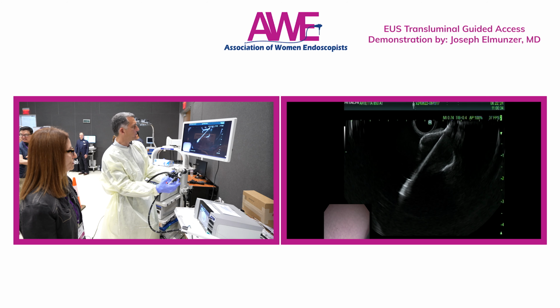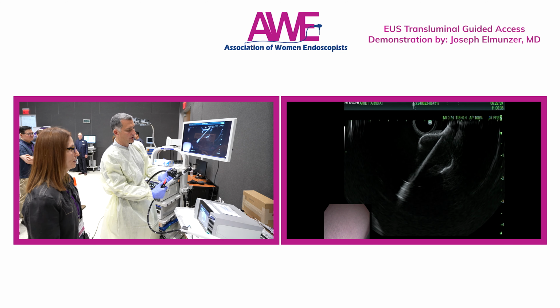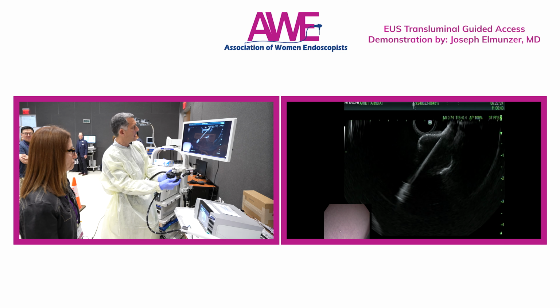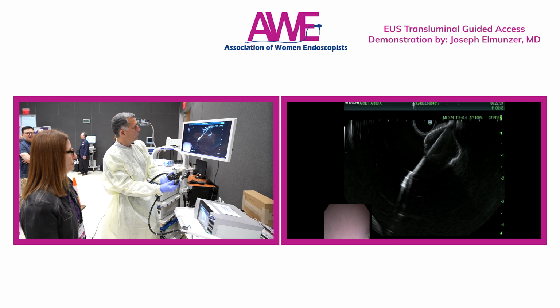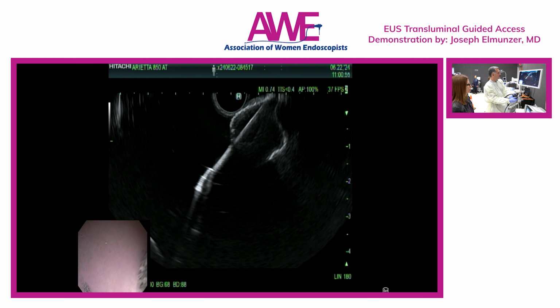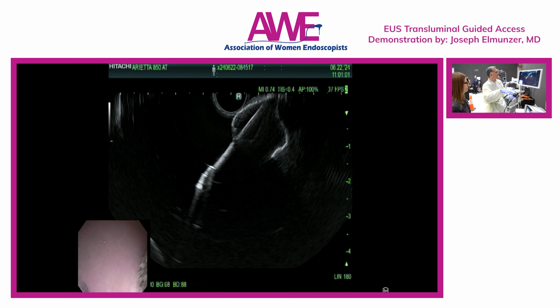Some people talk about the deformity of the actual stent, but what I typically use is, you'll notice there's that white line in the middle of the prosthesis, and I actually pull back until that white line is almost touching the lateral aspect of the prosthesis. So I like that sort of angle to be almost gone. And once you achieve that and lock your catheter hub again, then I think you almost always, regardless of the distance, have enough proximal flange in your channel.